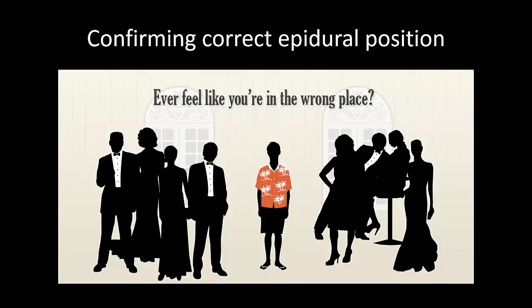Ultrasound imaging will help you find your way past the bony lamina and into the epidural space. It does not by itself confirm that your needle or catheter will lie within the epidural space, although you can be more confident that any loss of resistance that is obtained is likely to be a true positive loss of resistance. I'm going to spend the last few minutes talking about ways to ensure that the epidural is correctly located once you have found your way into the interlaminar space and that the catheter stays that way.